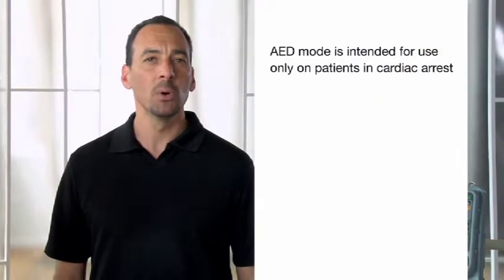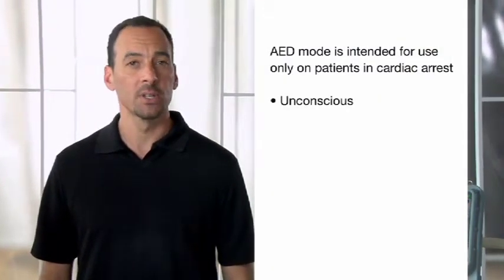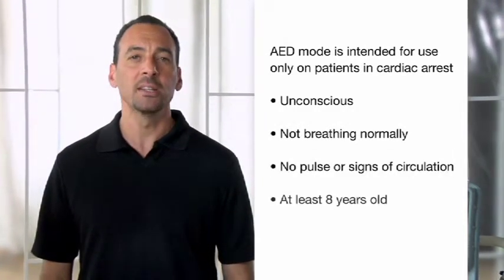When the LifePac 15 monitor defibrillator is set up to power on in AED mode, it follows a predetermined protocol. AED mode is intended for use only on patients in cardiac arrest who are unconscious, not breathing normally, with no pulse or other signs of circulation, and at least 8 years old. We're going to look at how AED mode operates using PhysioControl default settings. But be aware that the 15 can be set up differently based on your organization's medical direction. Make sure you're familiar with how your 15 is set up for your protocols.